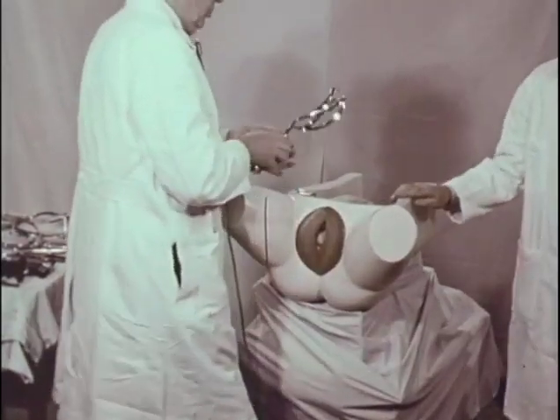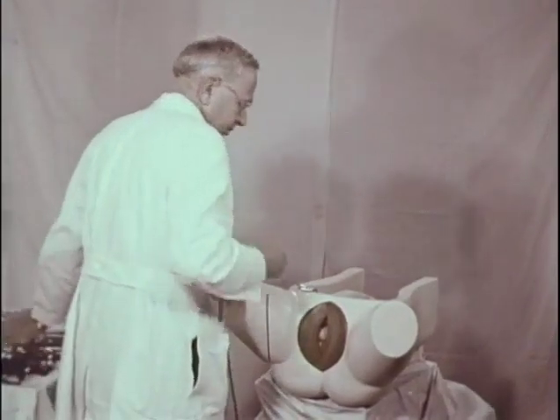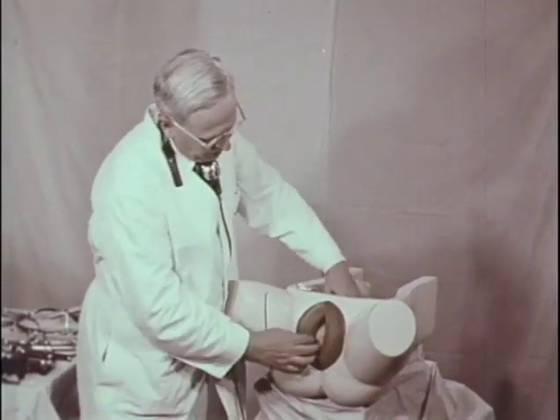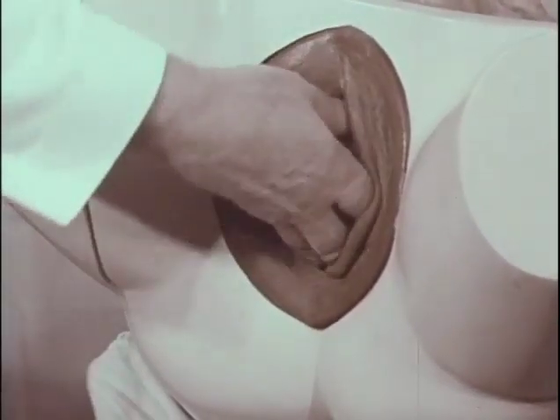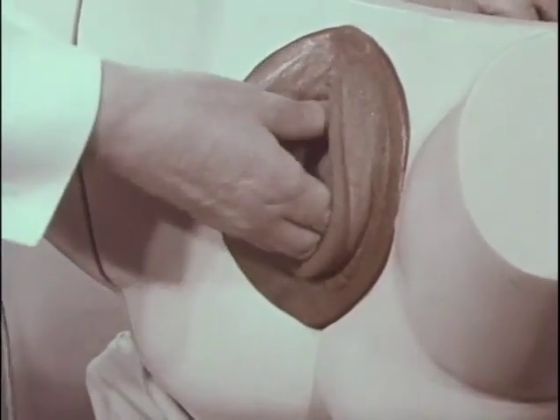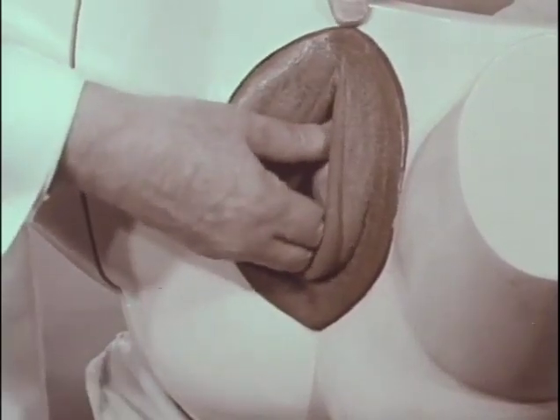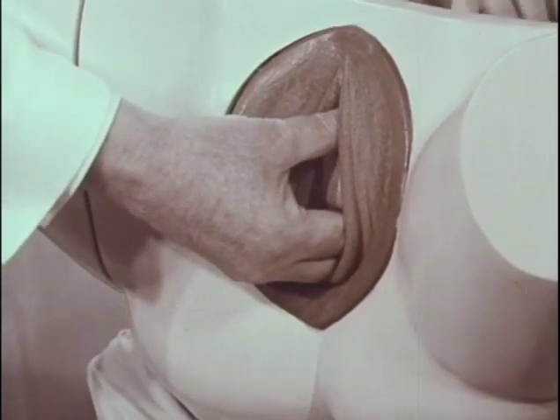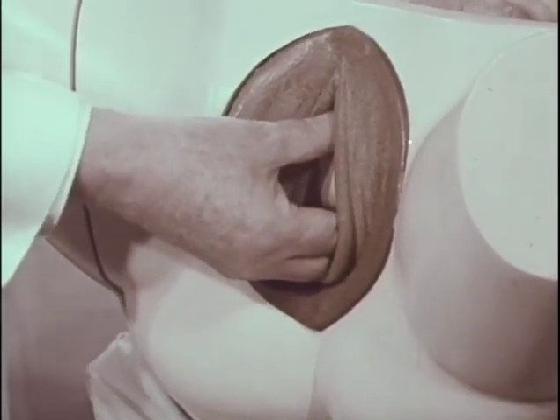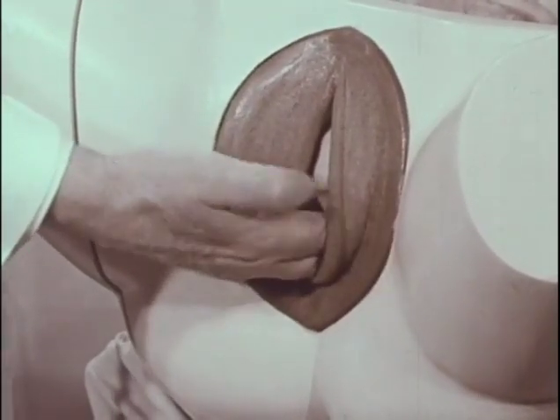Now in the manual maneuver, the one which carries with it the hazard of displacement of the head, because if the head is in the low-mid station, there's not sufficient room to permit the introduction of the entire hand without displacement. However, some heads that are in mid-station or just below, the hand may be inserted without as much risk of displacement. And the right hand is the rotating hand in left-sided positions.